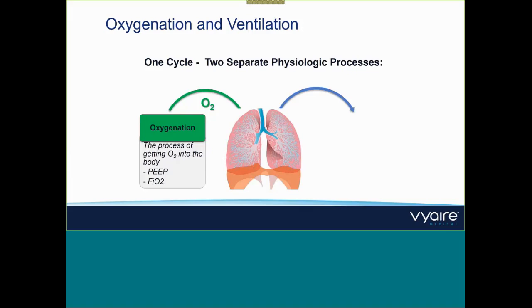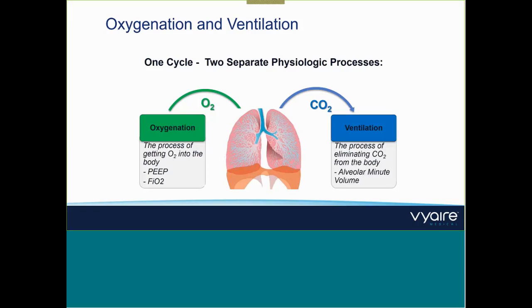On the other side, we are talking about ventilation, and I already talked about this process a bit during the AVM webinar. So we have oxygenation and ventilation, and responsible for the ventilation and for eliminating CO2 from the body into the air, into the atmosphere, is the minute volume. The minute volume is a summarized value, which could be coming from the rate, from the tidal volume, from the inspiratory pressure, but all of them just contribute at the end to the minute volume.